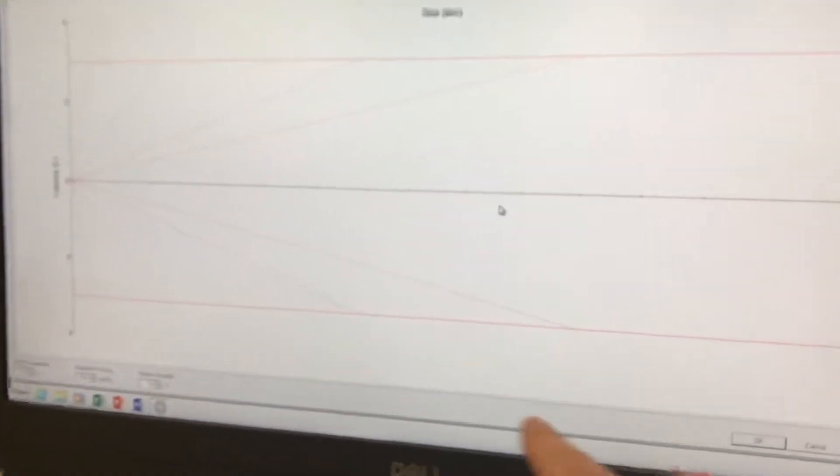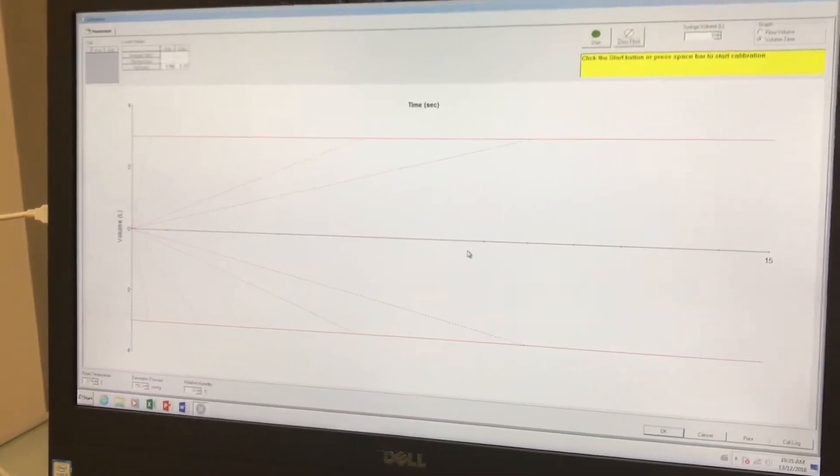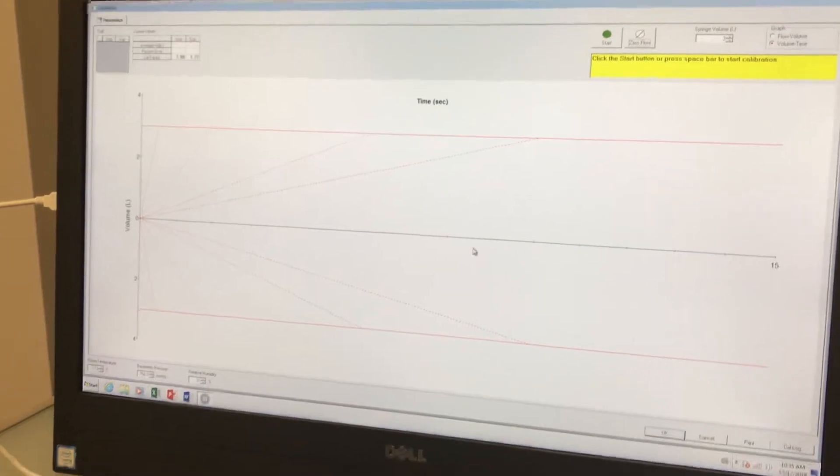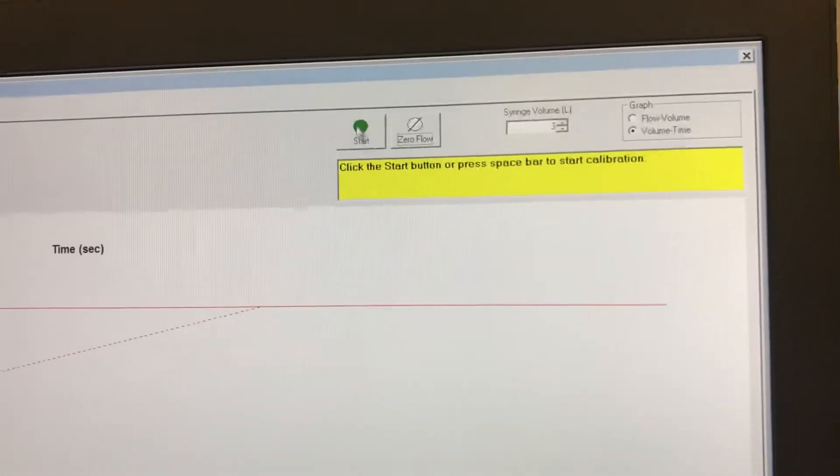This area down here is where you're going to find the instructions for when to withdraw and when to inject. Ensure that the syringe plunger is all the way in before you start, and now you can click on the start button.